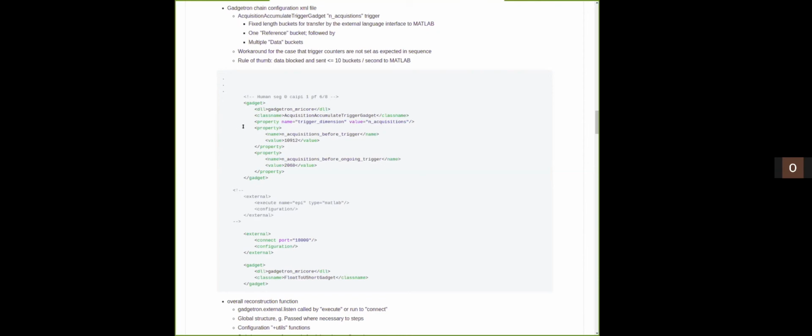Also, just because it is prototyping, it turned out that some of the flags for the counter for repetitions were not set up in a way that the repetitions trigger dimension would operate. So one of the few bits of C++ I've done is to add this in acquisitions prototyping buffering method, which is a pain in the backside. And I'm sorry to everyone who has to use this, because you have to manually figure out what these numbers should be, and it's different for every single acquisition.